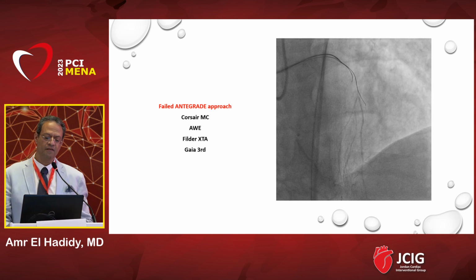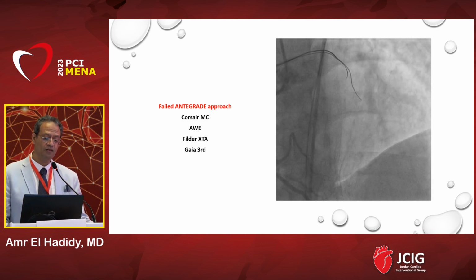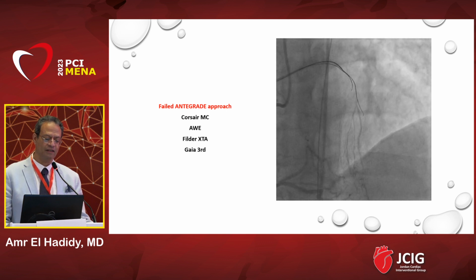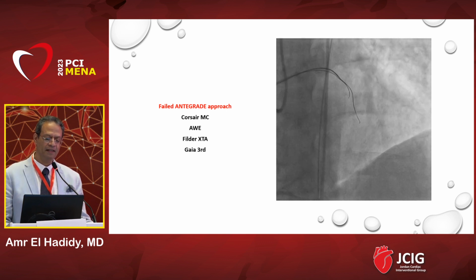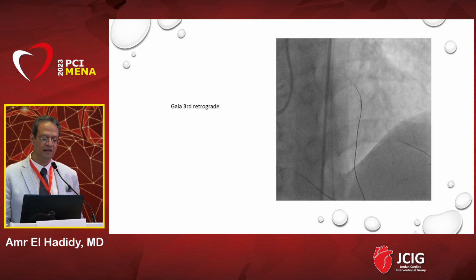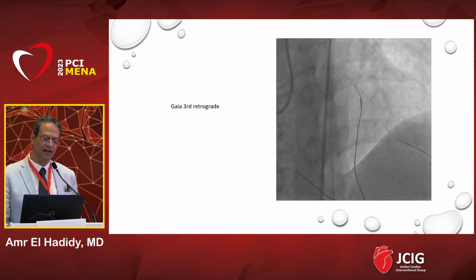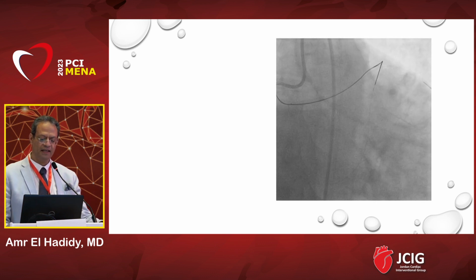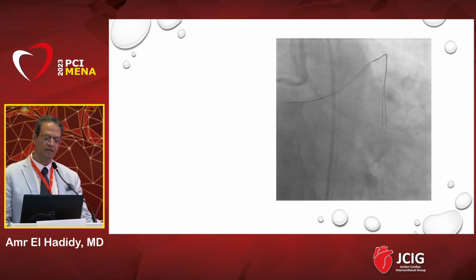3rd, is coming from the retrograde septal to the diagonal branch, and you need to externalize. We externalize, as you see, and we do it in the antegrade guiding, and this is how to do this case, with several balloon dilatations. Then definitely you need to look at the final result in this case, and the very good filling of the LAD after using a small balloon, and this is the final result.